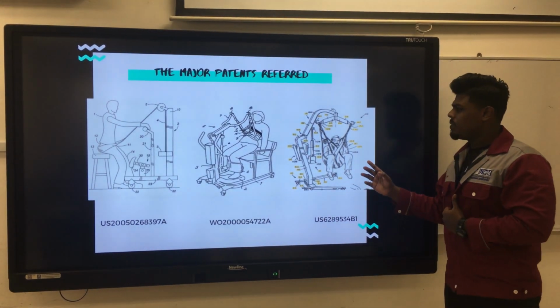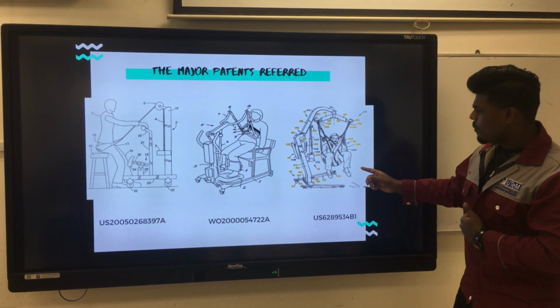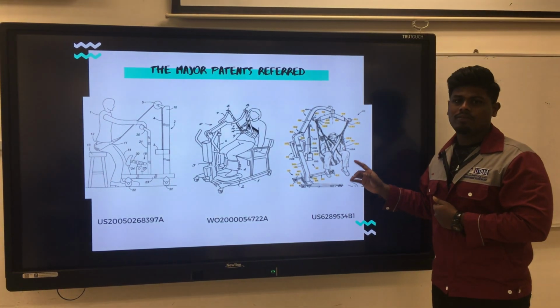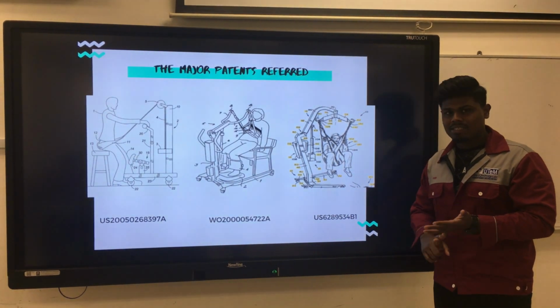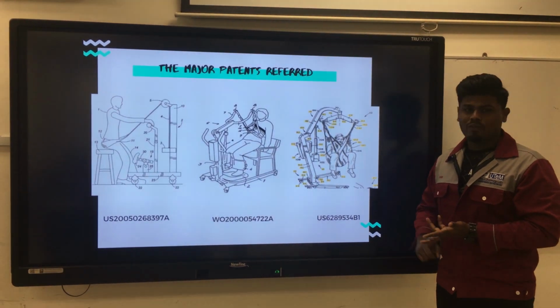The last prototype will be this prototype, which is to secure the patient or the immobile person fully before they are transported. So in this, we are simply comprising of safety, transportation, and as well of functionality.